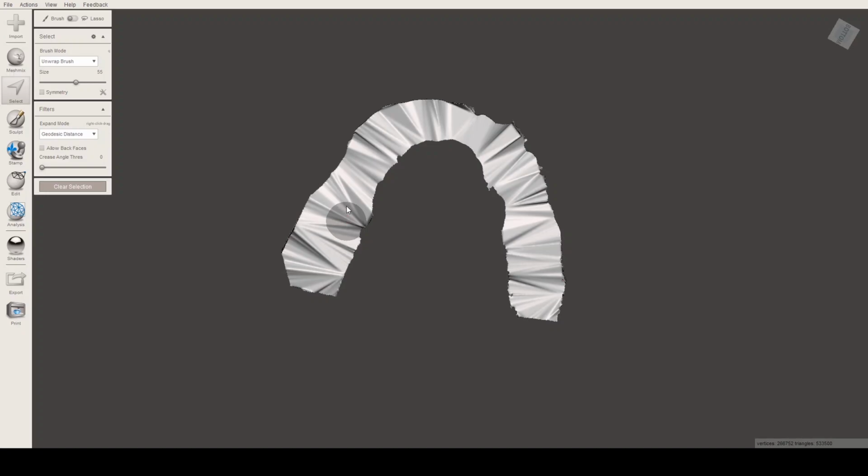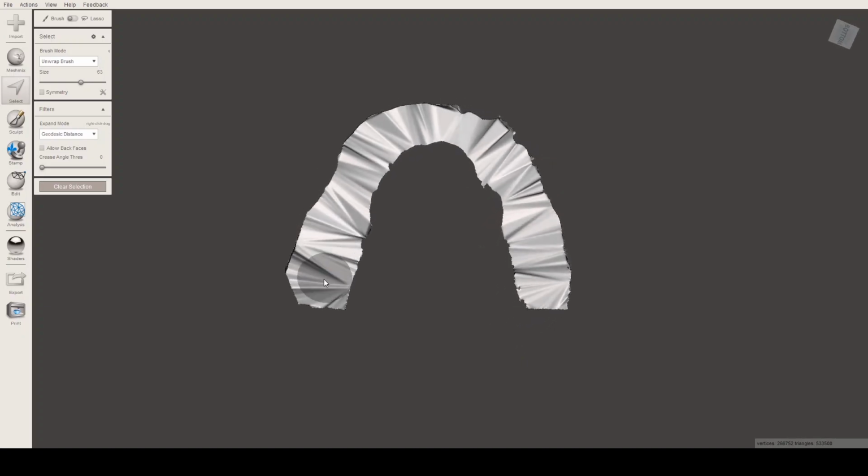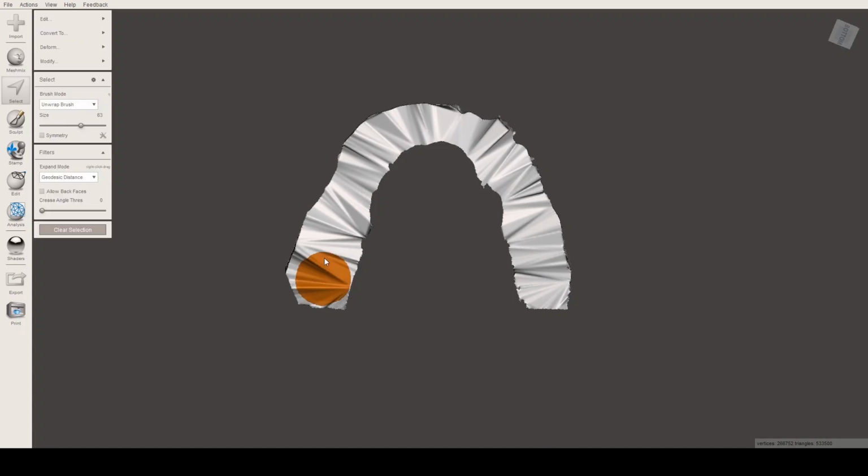But if you're gonna try to make a 3D model, you might want to layer your object, because we want spaces from there. And we actually want to make it equal. So what we're gonna do is have a bigger select cursor right here, no gaps, and then let's turn it smaller. So what I'm doing now is I'm using the resize hotkey. You can use this scale or this size button, but for my convenience I'm using the keyboard. I'm utilizing the keyboard as well, so it can be easier to mark things with my select cursor. So there you go. Let's make it bigger now.